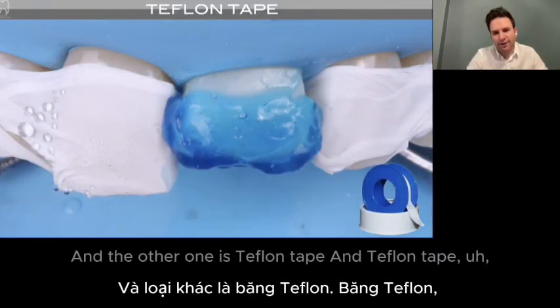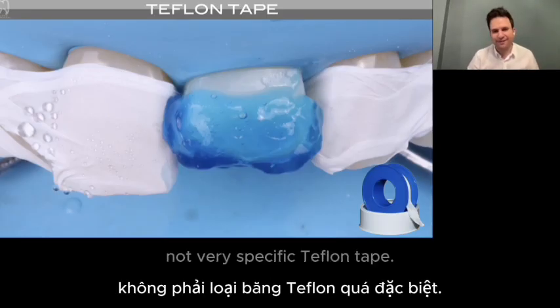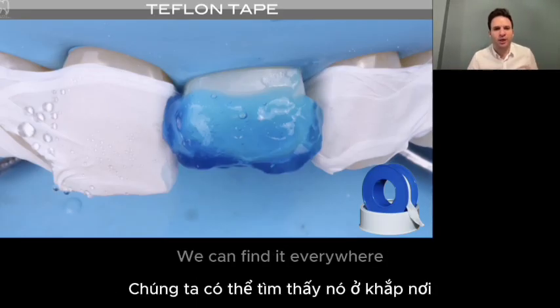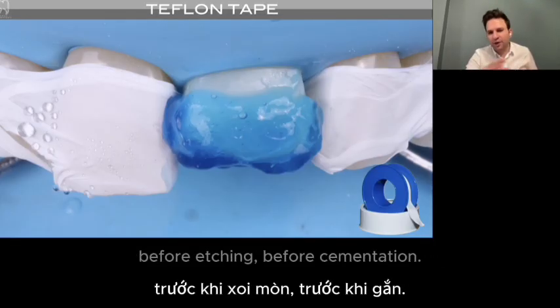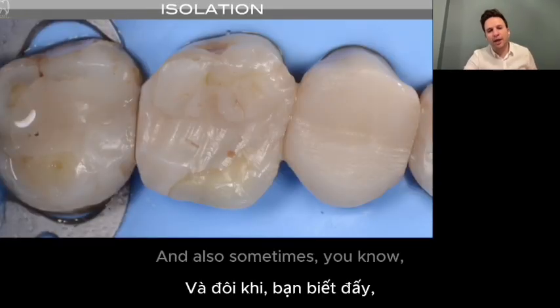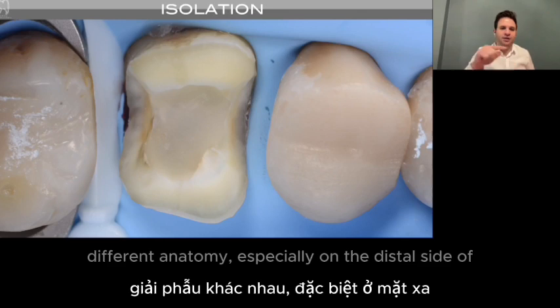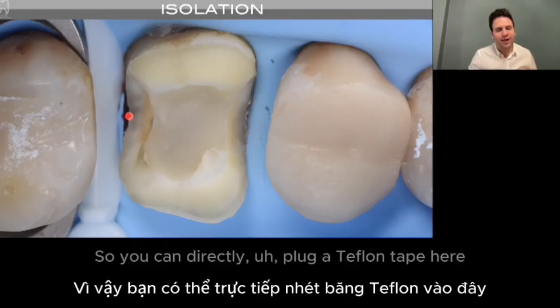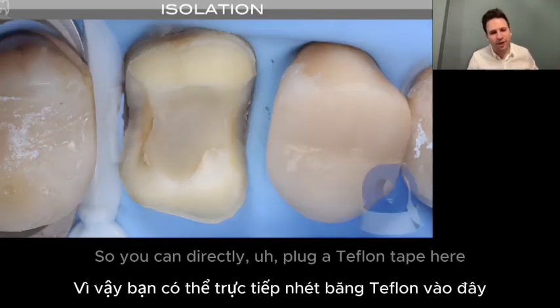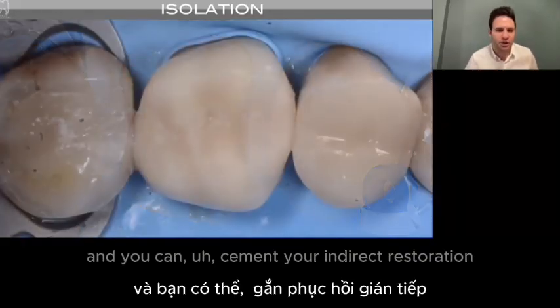And the other one is Teflon tape. The Teflon tape that we use in dentistry is not very specific Teflon tape. We can find it everywhere, and it can isolate the adjacent tooth before etching, before cementation, and also sometimes the tooth may have some different anatomy, especially on the distal side of that tooth here. So you can directly plug a Teflon tape here and you can cement your indirect restoration.